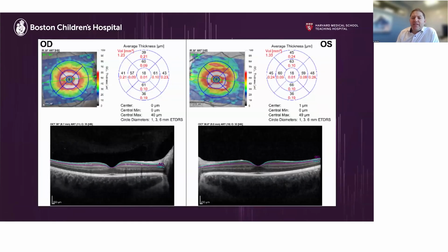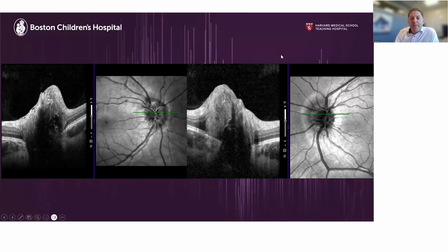Then I look at his ganglion cell layer, and since he had excellent visual fields and excellent vision, I would pretty much assume that this would be normal, and it is. You really can't be too high in terms of the ganglion cell layer. So 1.33 is considered normal. The only time where it becomes pathologic is if you have some kind of intraretinal ischemia and edema in the intraretinal layers, like a CRAO, or acute areas of ischemia, or if you have too many white blood cells from CML or other kinds of leukemia and have some focal ischemia, that can become too thick, but that's much, much thicker than this. And then we do an EDI-OCT.